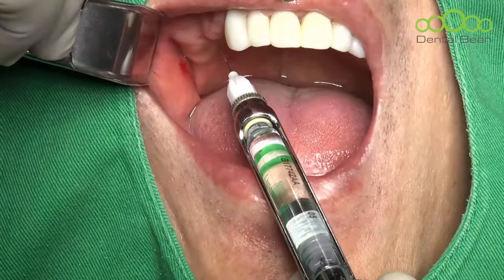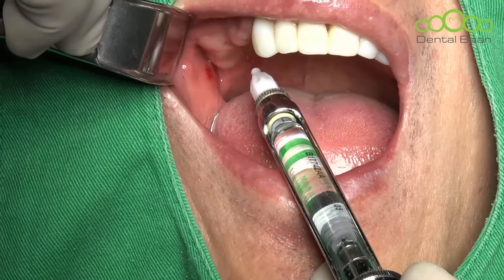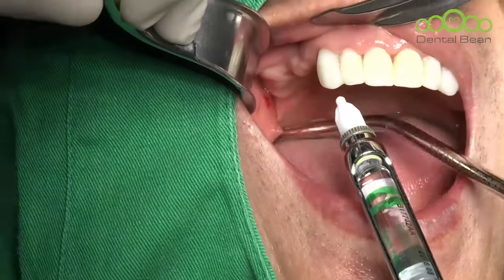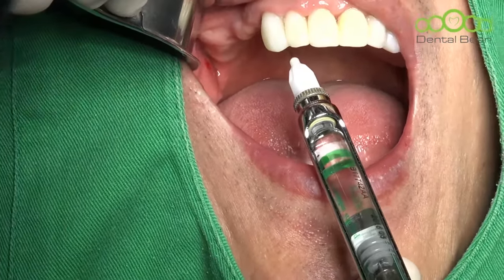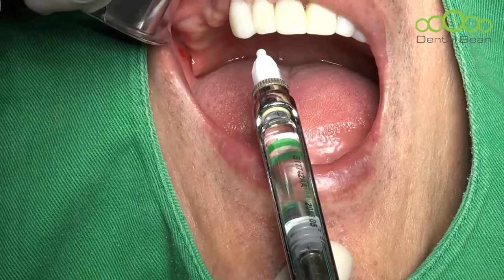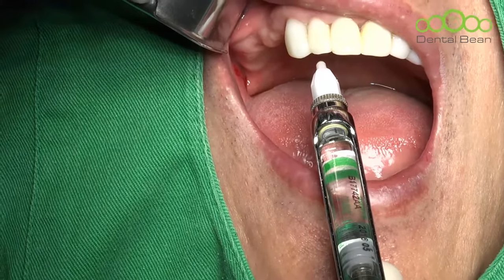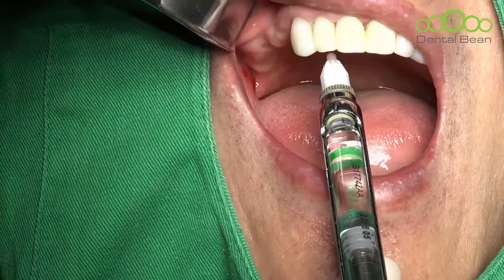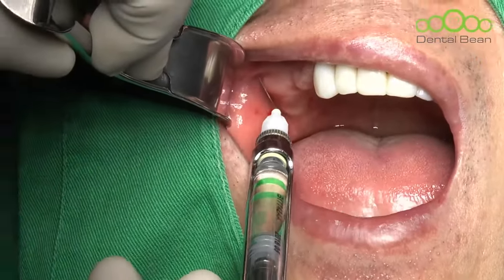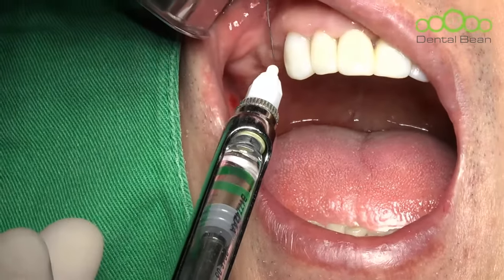I'm blocking the posterior, the greater palatine nerve, and anterior. Usually I spend half of the second cartridge to block and infiltrate the palatal side. I must be slow. Almost I spent half. Then the remaining portion will be spent for additional infiltration on the buccal side. With this, I can finish anesthesia completely.